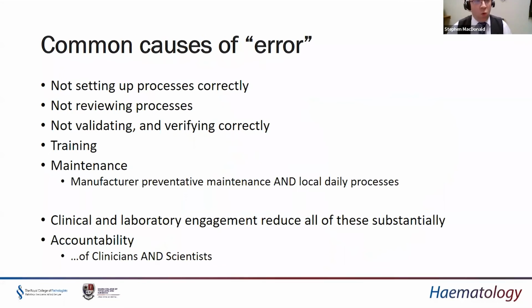But no matter what we do, there are always going to be errors. And there's always going to be things that we need to investigate or troubleshoot or improve, which will crop up periodically or over time that we need to investigate. So where might those errors come from? They could be from not setting up processes correctly in the first place, and that's a very common thing.